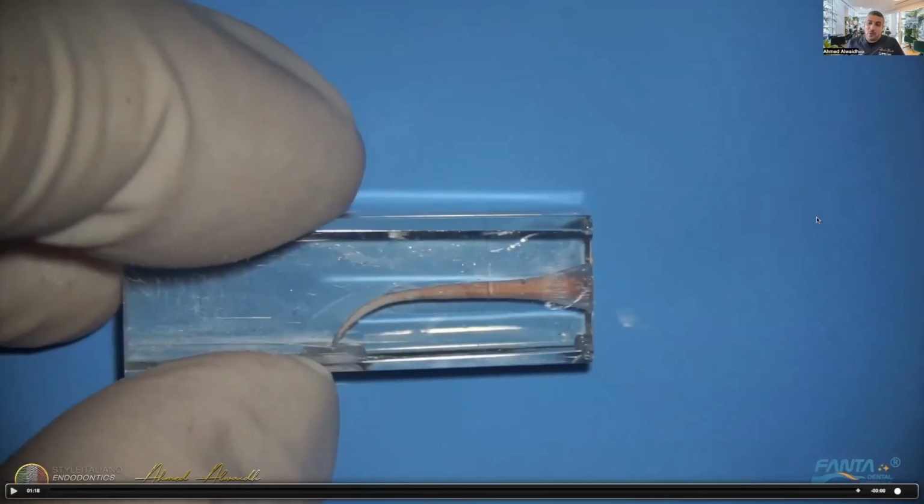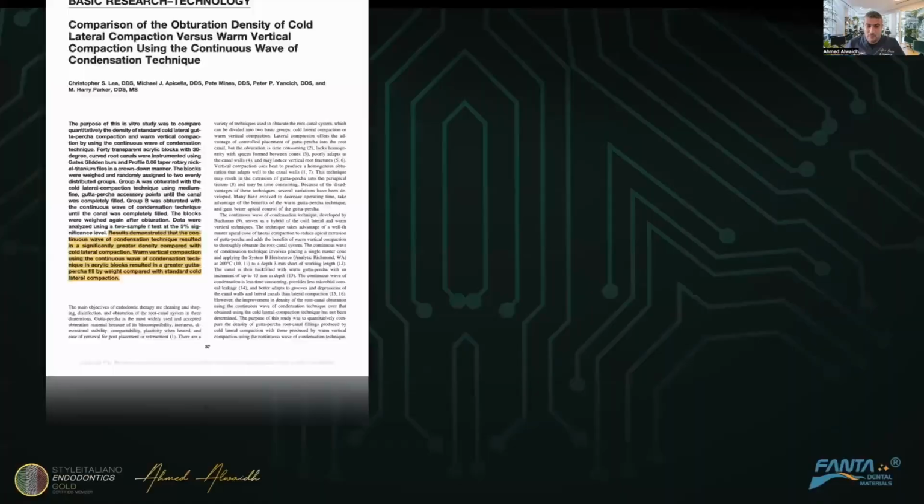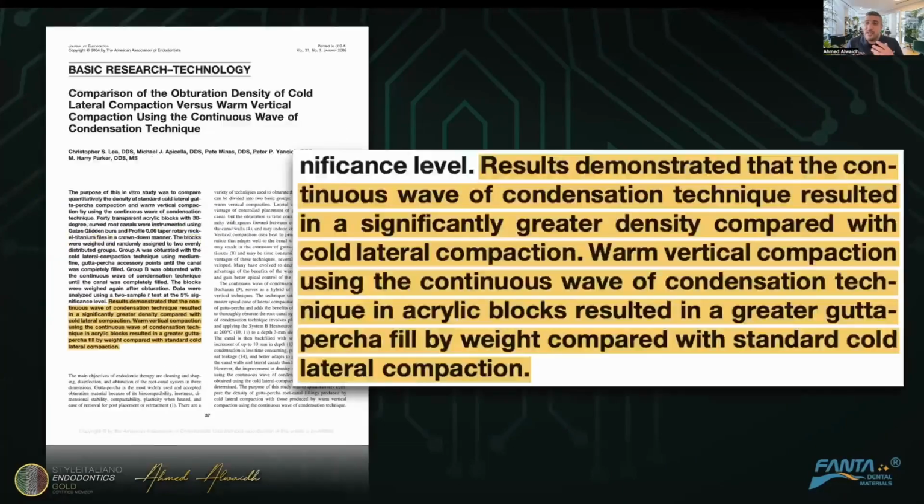So this is the continuous wave of condensation. Now, is there any difference clinically or in terms of outcomes between the cold lateral and the thermal obturation?